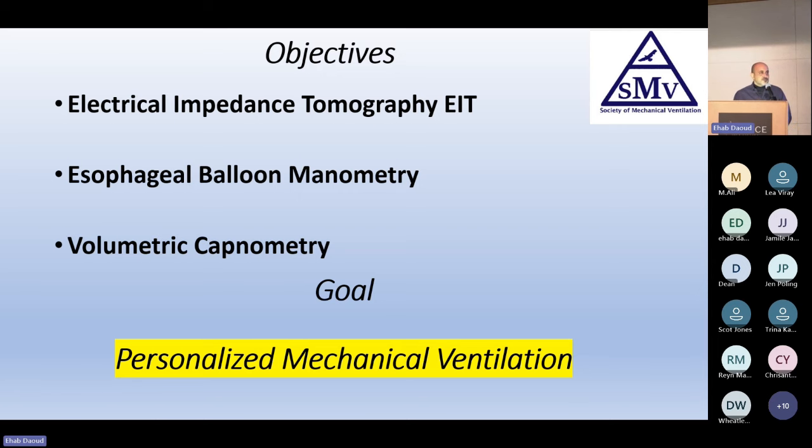So my goal from this presentation is to briefly talk about them, their technology, how to use them, and some ways that we can benefit from them. And my goal is personalized mechanical ventilation. So not everybody should be at 6 milliliters per kg or 15 centimeters of driving pressure. We give the patient what they need without causing or reducing the ventilator-induced lung injury.